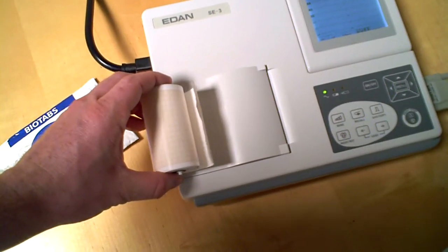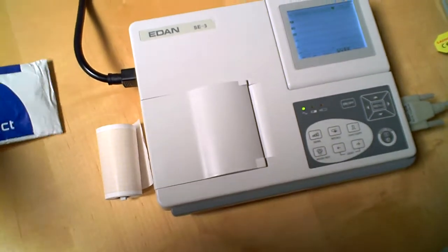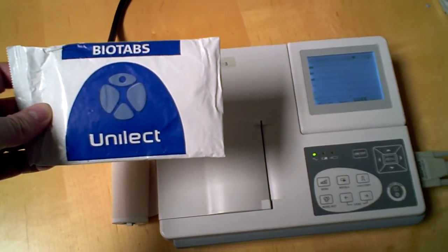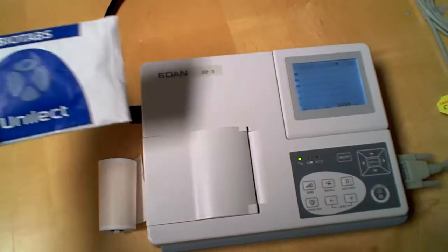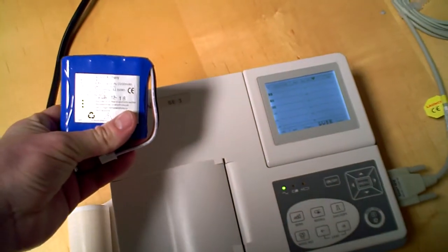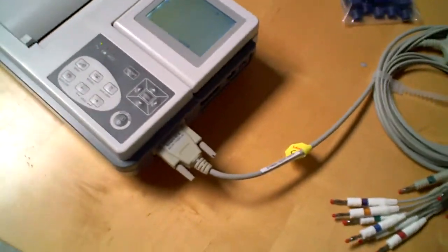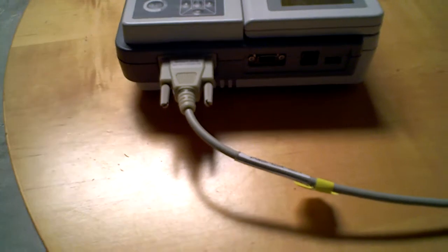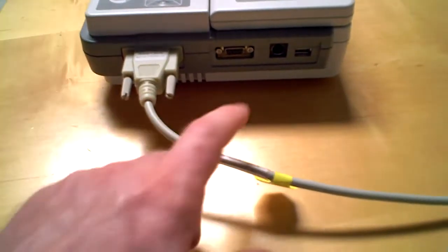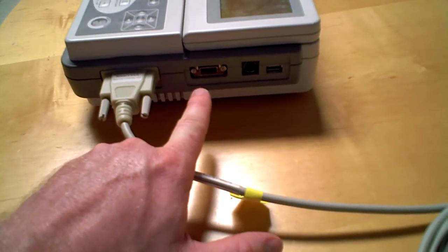Paper will go in there and it will spit out. All of our EKGs, and essentially all of our machines, come patient-ready, so it does come with a packet of electrodes. It does come with a battery that can be connected. You'll notice that this is where the patient lead cable will connect. You have a serial port here for transmission of data, especially for EMR.